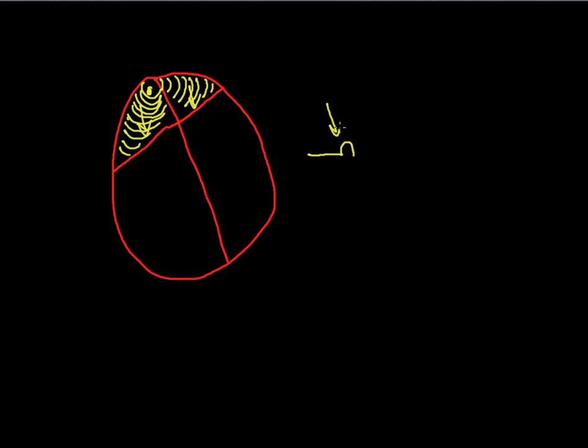So let's get an arrow there, and that's atrial depolarization. Sorry, I'm going to abbreviate here a little bit, just in order to save some space. But the atrial depolarization here. And he wasn't sure exactly how this fit in the cycle, so he arbitrarily chose the letter P to start this process off, and he called this a P wave. So a P wave represents the atria when they're depolarizing.